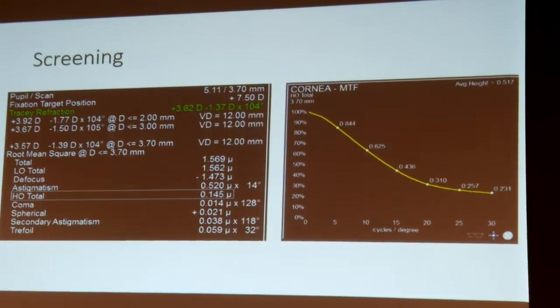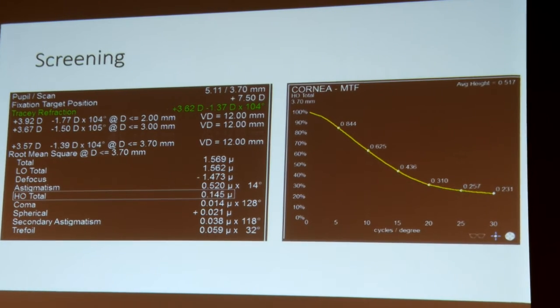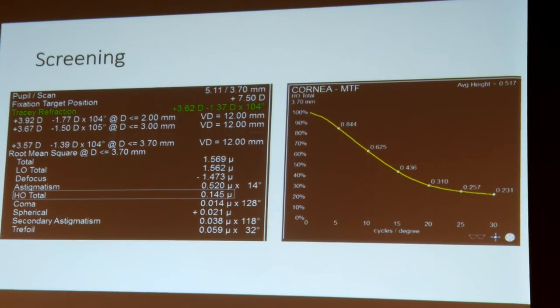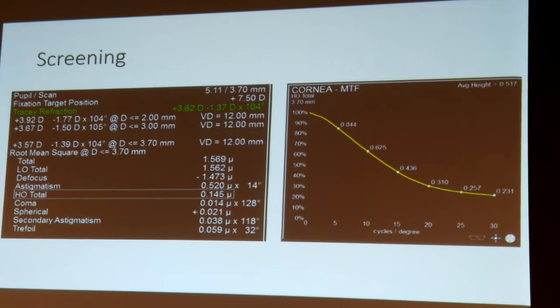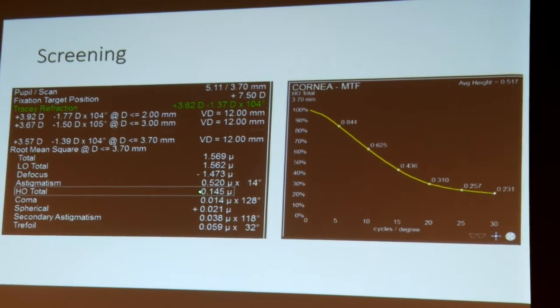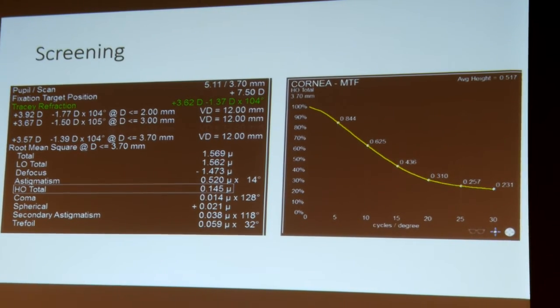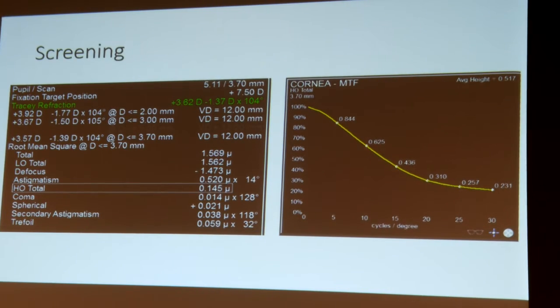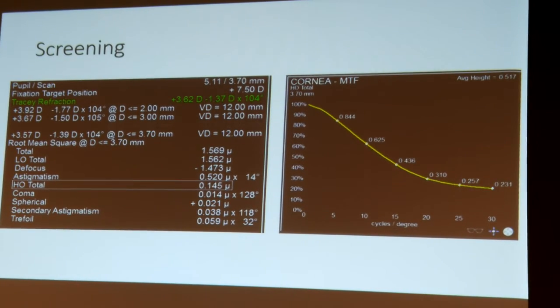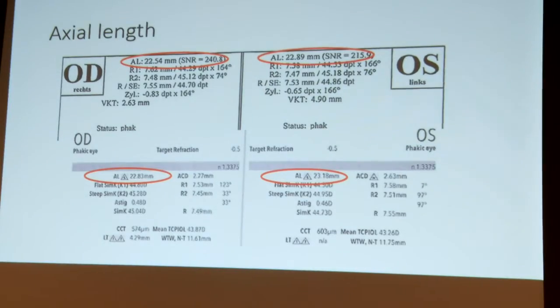Before I start with all the measurements, if patients pop in for other ophthalmology problems, and they ask, oh, what do you think, would it be possible to have one of those multifocal lenses? I often use the iTrace as a quick screening exam, so just do one iTrace exam, look at the high order aberrations, and look at pupil size, and then I look at the corneal function of the MTF curve from the cornea. If this is sufficient, then it looks possible. But then we have to do all the other things and measurements. If you're familiar with the iTrace, the measurement takes 30 seconds each eye, and then just those 2 pictures and you're done.